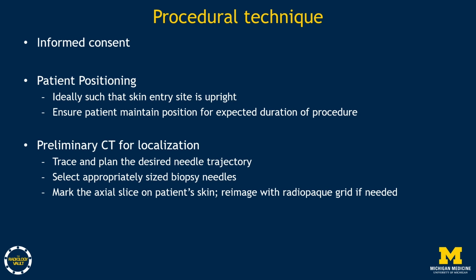After consent is obtained, the patient is placed in the CT table in the desired position, ideally in a manner such that the skin entry is upright, although this is not always possible. Make sure prior to scanning that the patient feels comfortable in the set position, as it may require maintaining for a significant period of time, sometimes 30 minutes or longer.